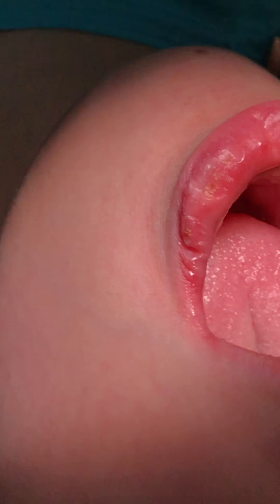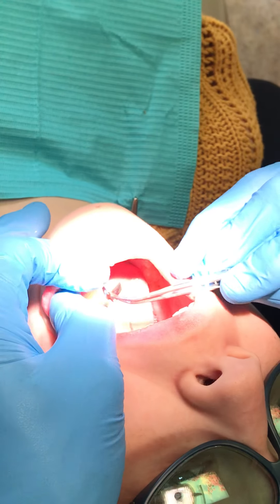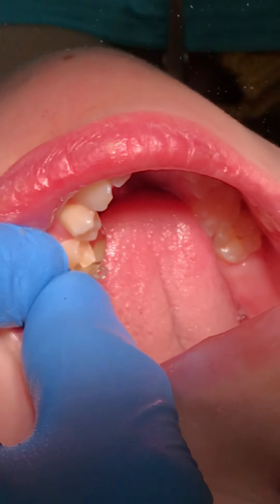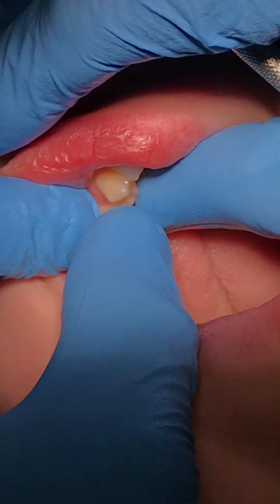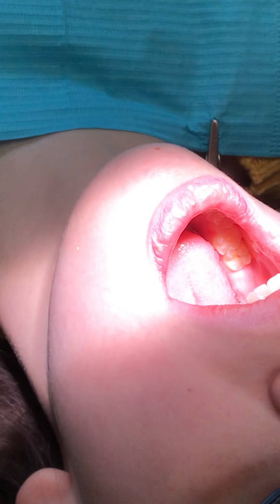Now for these restorations I like to use this physiologic matrix — what I call a Garrison system. It's not flat like the regular Toffelmeyer. What I like to do is contour it — this is not a big fat molar, so I'm going to contour this so it's a little bit smaller because we're dealing with a premolar. I'll seat it here. The most important thing is it needs to go past the bottom of the proximal box. I don't want any bleeding in this situation, so I want to maintain it like that, and then we're going to use a wedge to keep it in position.